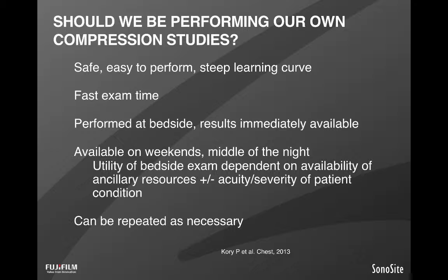Well, I'll tell you, in most institutions that I've worked with and in my experience, nobody can be as fast as me taking an ultrasound machine to the bedside, examining the vein, and making my own decision and applying it to the clinical situation that I'm dealing with. I can also repeat it as often as necessary as things change, whereas ordering and reordering from some of our ancillary colleagues can be a challenge.